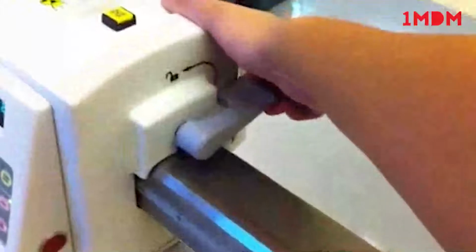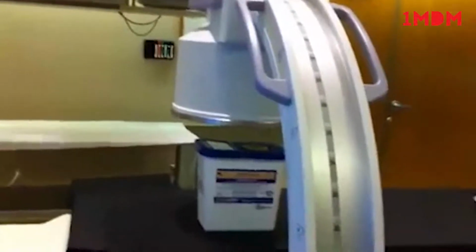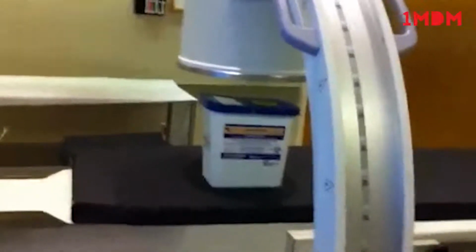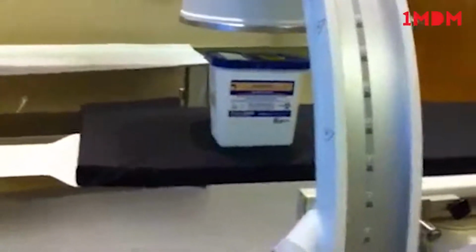So the machine's going to wobble, and again, you can lose your alignment. So this is what I do. I unlock this lock right here, and I push it in till I'm roughly center. A lot of times, I may not be a perfectly experienced tech. I've been doing this for 2 years, but I still don't get this perfect sometimes. I just have to go in and shoot and find out, and make my correction based on it. So there we go. It is locked.